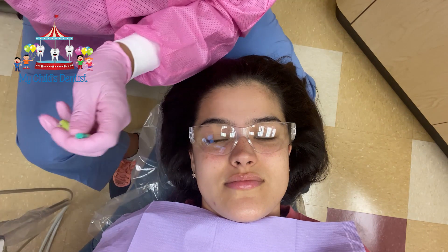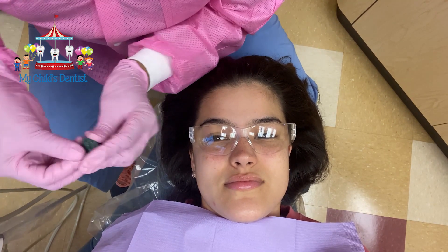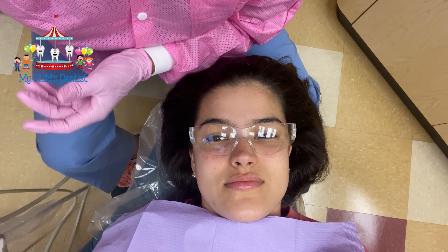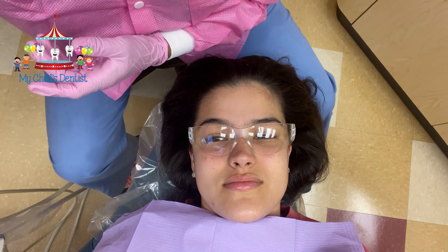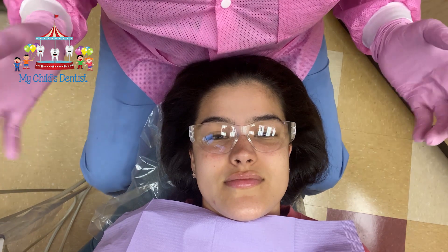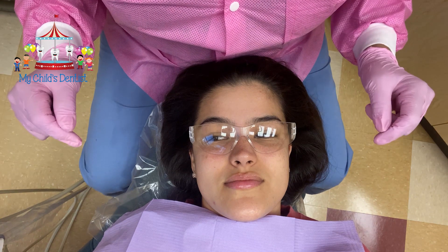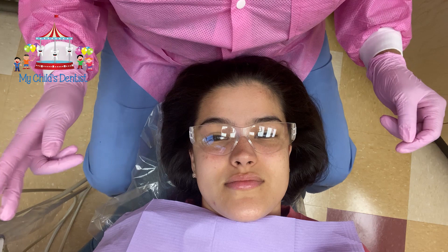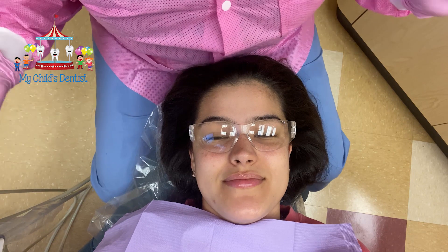Our second item is the cup that we use when we polish your teeth. I'm going to go ahead and open this and set it up — our individual tooth polish and our fluoride treatment are all individually packaged. When we're all finished, I'm going to show you that our wipes, ordered from a dental company, have been shown to kill bacteria and viruses, including coronavirus, which is the culprit in this pandemic.